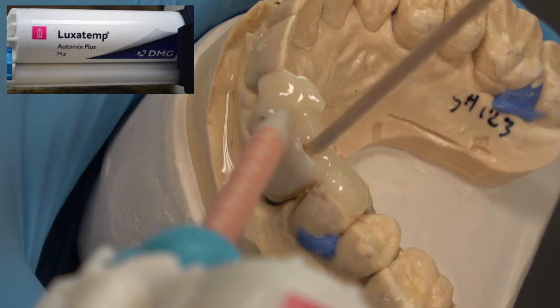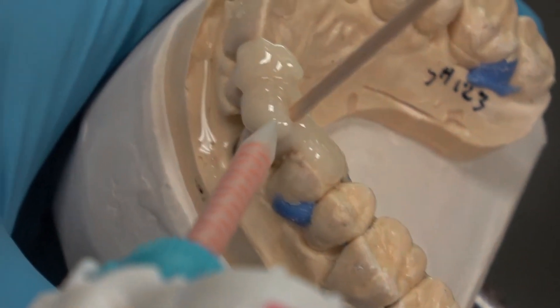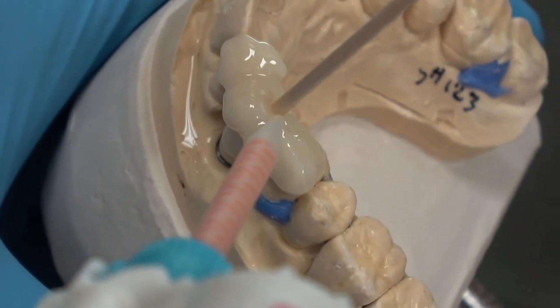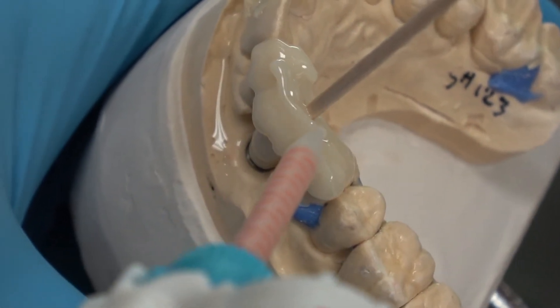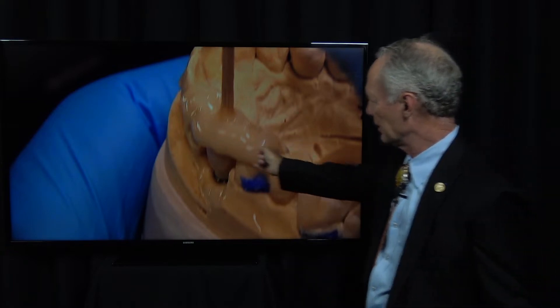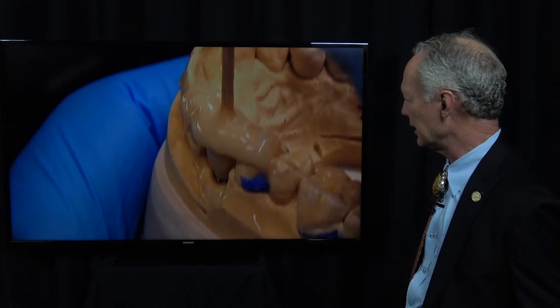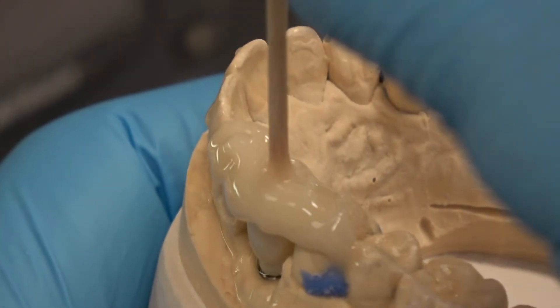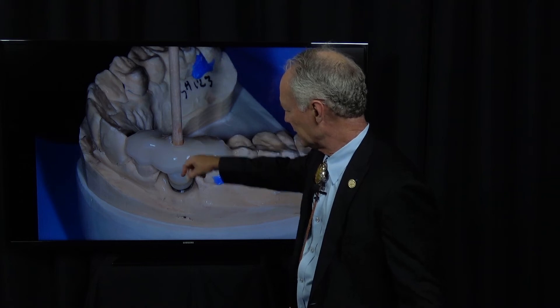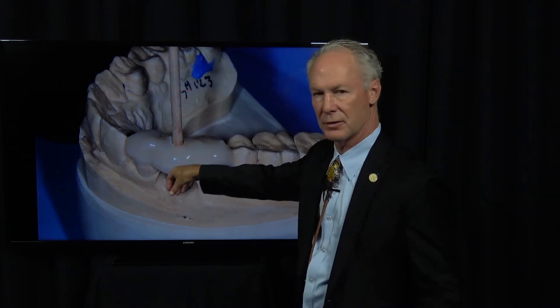Now I'm making a seating jig. If your laboratory doesn't send you a seating jig, you can make one like this — a cotton tip applicator in the orifice, and then Luxatemp that I'm flowing on the adjacent teeth so that I know the crown is seating ideally. This ensures that the crown is positioned perfectly when you screw the implant abutment and crown into place. Even with a single crown, I like a seating jig.